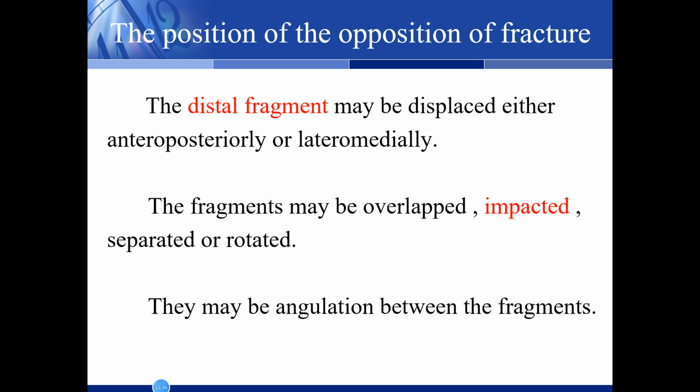The position and opposition of the fracture. The distal fragment may be displaced either anteroposteriorly or lateromedially. The fragments may be overlapped, impacted, separated, or rotated. There may be angulation between the fragments.